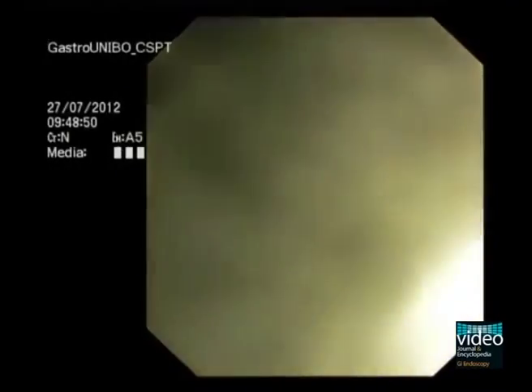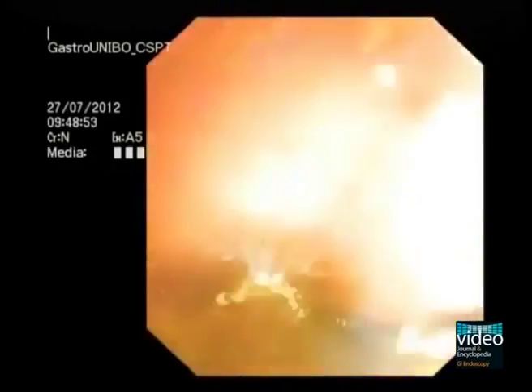At the end of the procedure, all the water is aspirated from the stomach for the sake of the patient's safety and comfort.